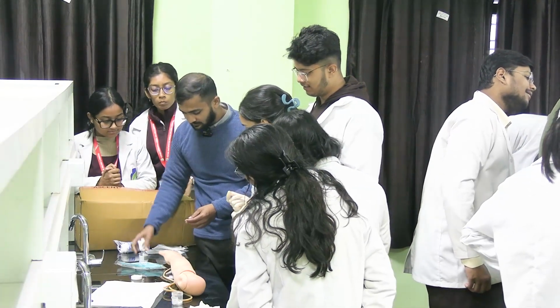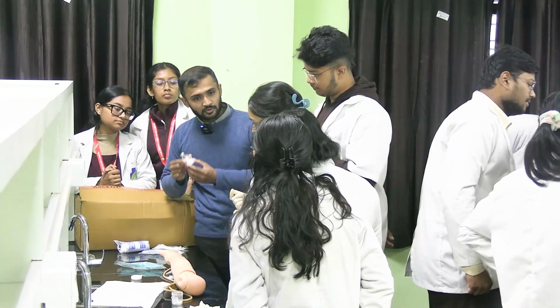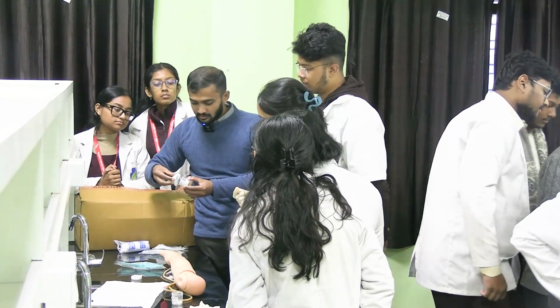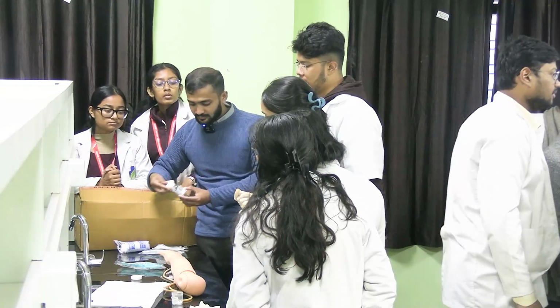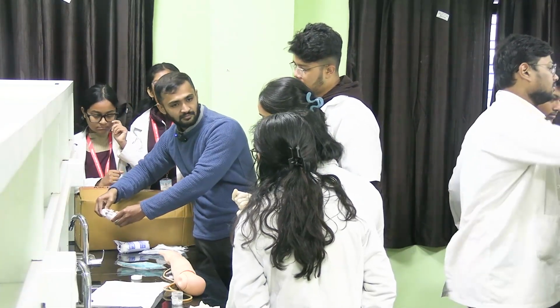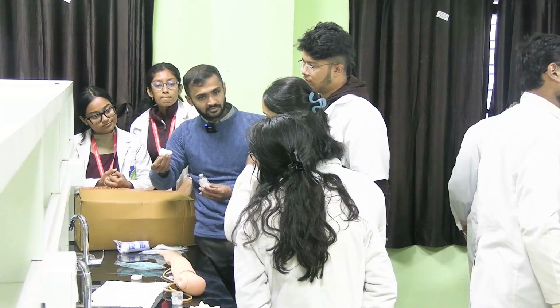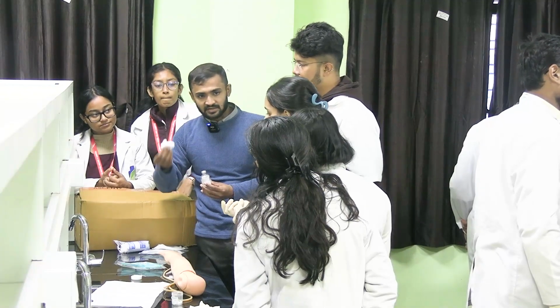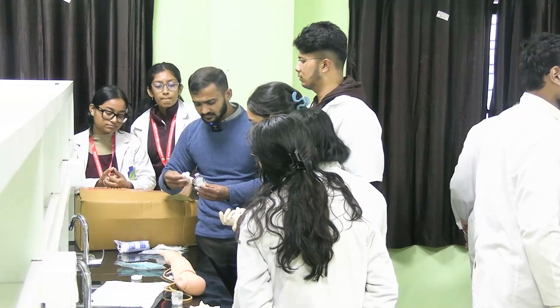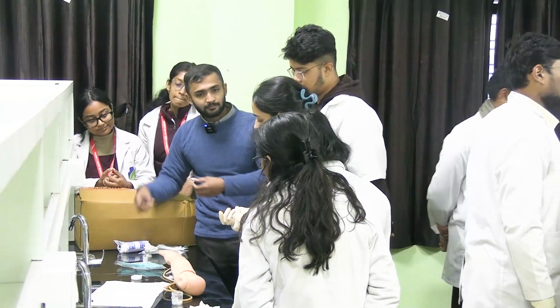Then there is a neck. Hold the base with the non-dominant hand, and with the dominant hand hold the neck, where there will be a line where it will break. At that part you have to press firmly, and it will break. Why am I using the gauze? So that the glass particles don't enter the fingers, and I do not injure myself with sharp objects. It will be saving me. So you have broken it.